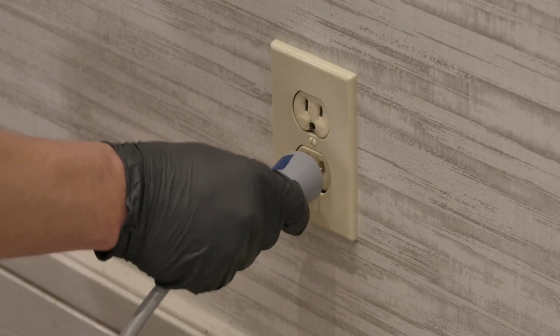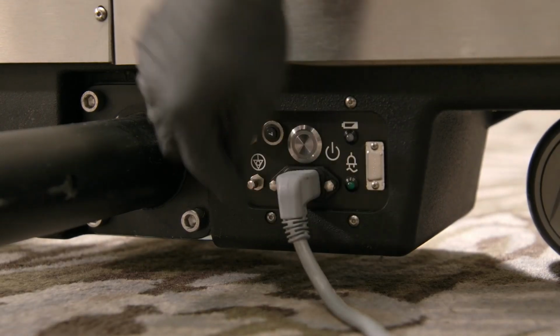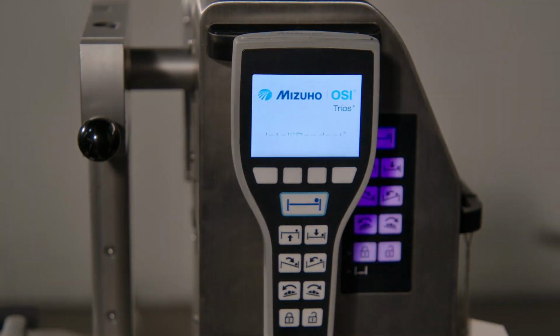Find a nearby outlet and plug the power cable in. Next, connect the power cable to the Trios table. Press the button directly above, it should illuminate green. Ensure that the hand pendant powers up.